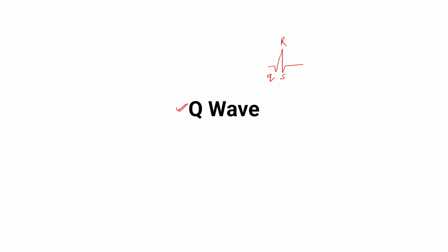What you need to understand is that the Q wave is the first negative wave in the QRS complex. The negative wave that precedes the R wave is the Q wave, the negative wave that follows the R wave is the S wave, and the first positive wave in the QRS complex is the R wave. I hope it is clear now.